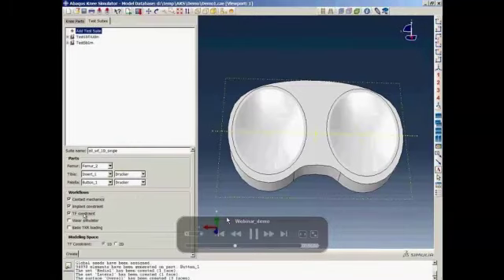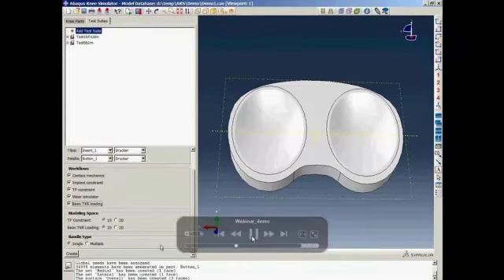And the user can select which workflows to be included. So for the tibial-femur constraint workflow, because we have representation of the soft tissue, the user can select to either represent the soft tissue as 1D element or 2D element. Similarly, for the basic total knee replacement loading workflow, they can choose the modeling space for the ligaments, and also for the quadriceps, they can model them either as a single bundle or multiple bundle. And in this case, we chose the simplest option so that the models will be generated in a reasonable amount of time.